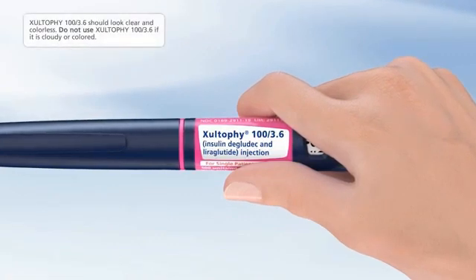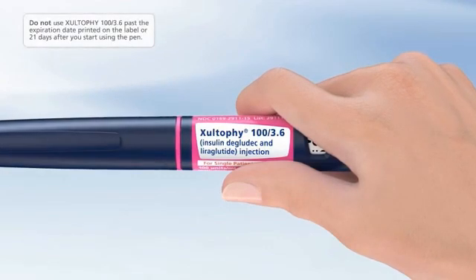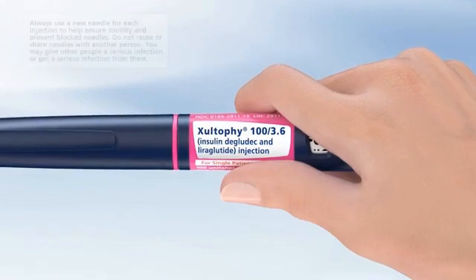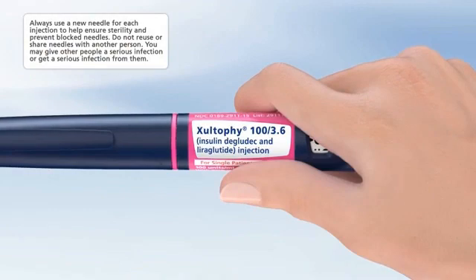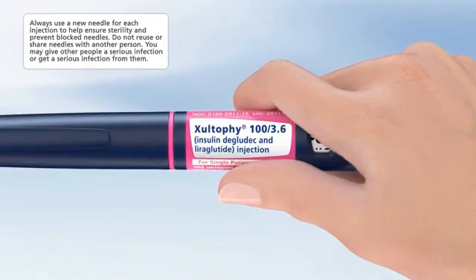Zultify 100 3.6 should look clear and colorless. Do not use Zultify 100 3.6 if it is cloudy or colored. Do not use Zultify 100 3.6 past the expiration date printed on the label, or 21 days after you start using the pen. Always use a new needle for each injection to help ensure sterility and prevent blocked needles. Do not reuse or share needles with another person. You may give other people a serious infection, or get a serious infection from them.